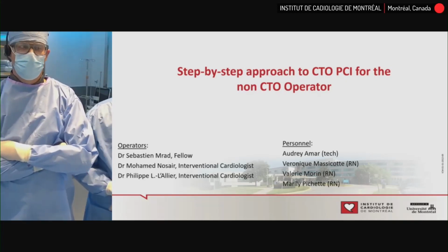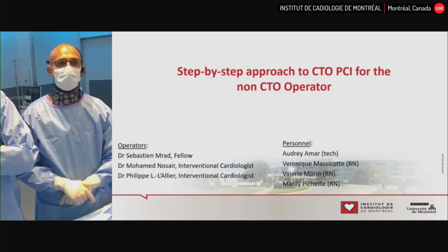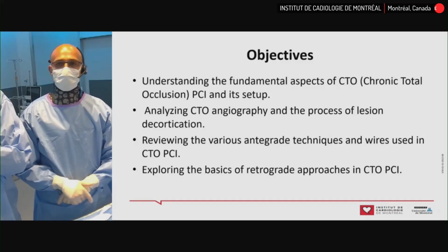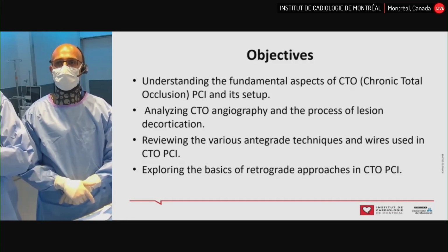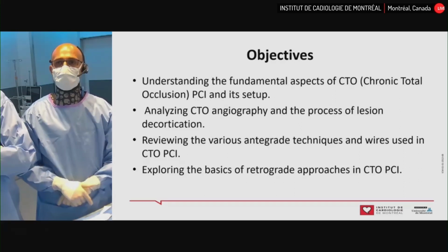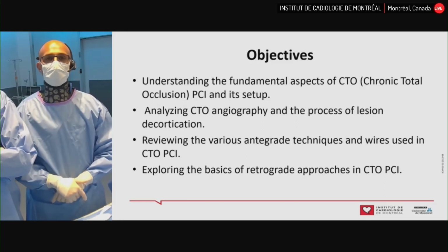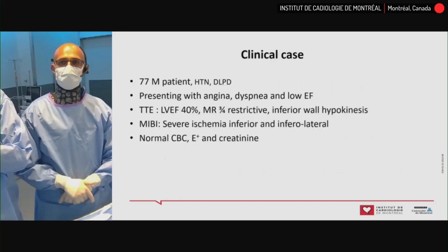Today, we'll be taking you through a step-by-step approach to CTO PCI for the non-CTO operator. The objectives of the case and the presentation are understanding the fundamental aspects of CTO PCI and its setup, analyzing CTO angiography and the process of lesion decortication, reviewing the various antegrade techniques and wires used in CTO PCI, and finally exploring the basics of retrograde approaches in CTO PCI.